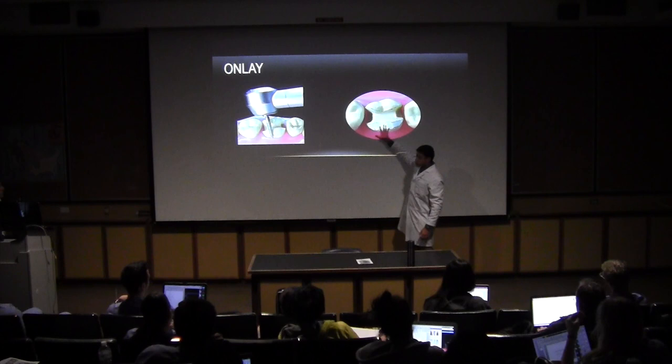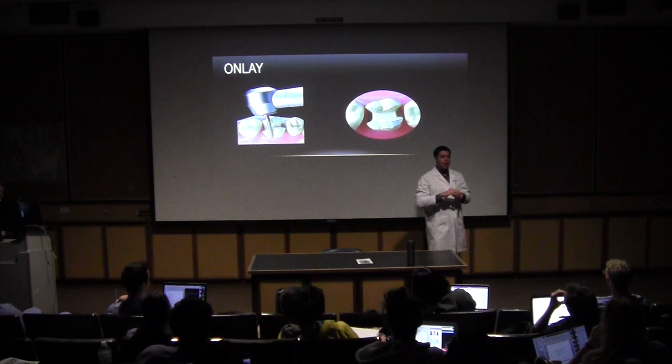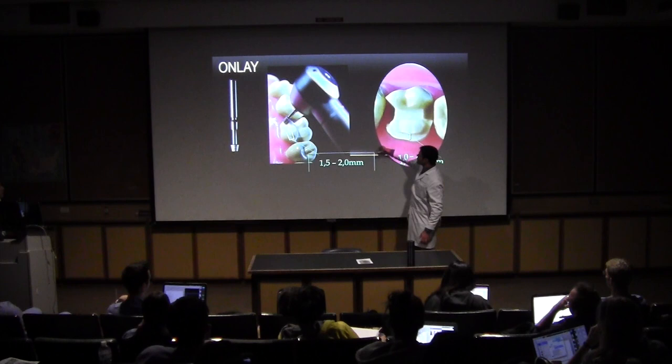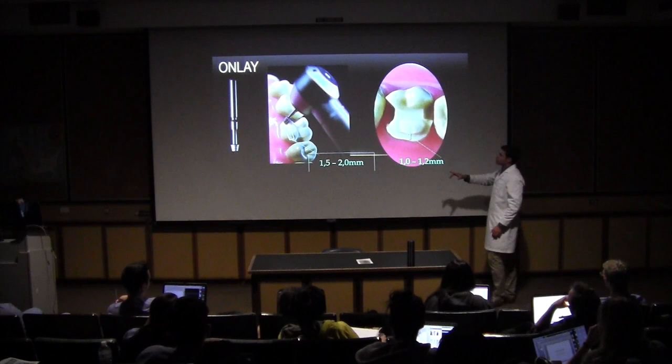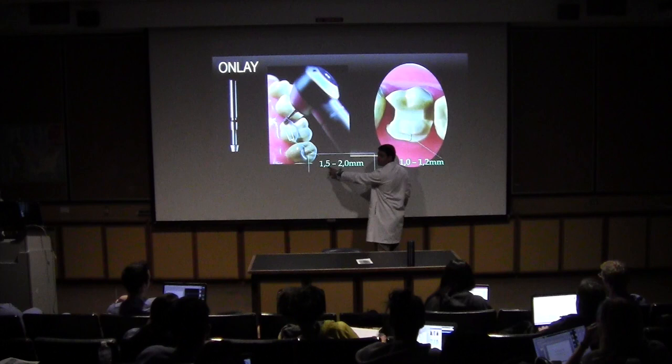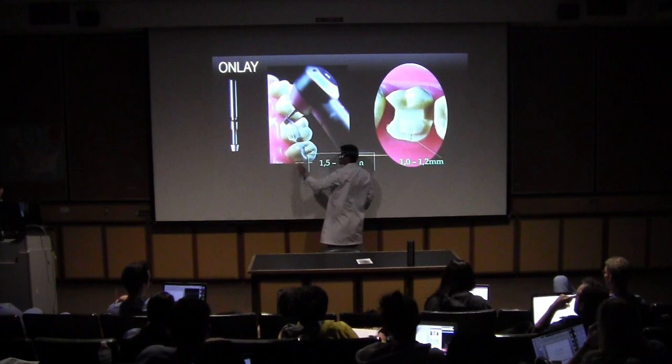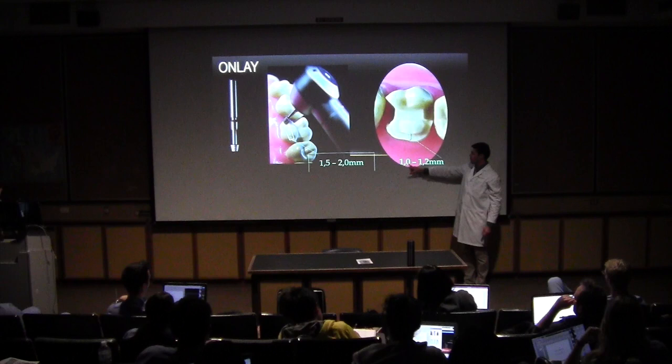After having these two flat surfaces, we are going to smooth and round the surface connecting these two surfaces, all right? So after connecting these two surfaces, we go to the shoulder preparation. And this shoulder preparation will be 1.5 to 2 millimeters from the top of the cusp after you shave it down. And the thickness of the shoulder will be between 1 to 1.2, all right?